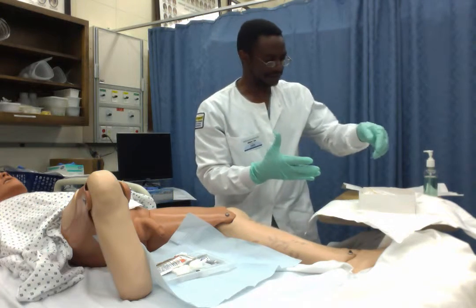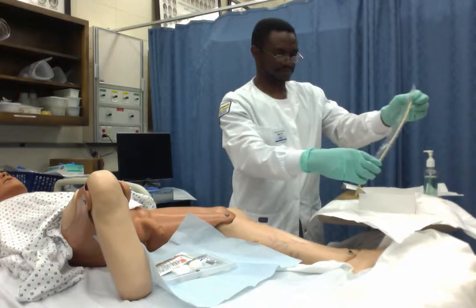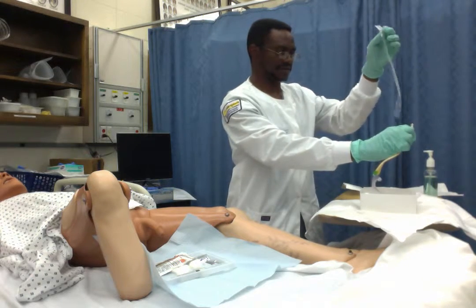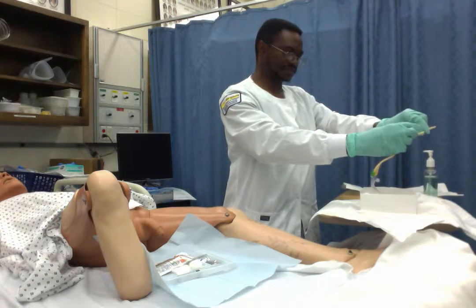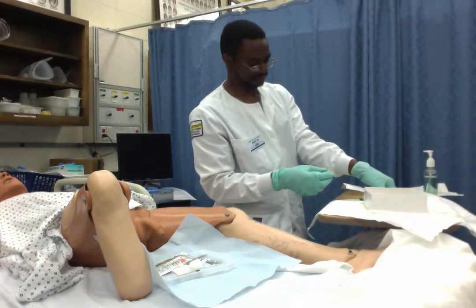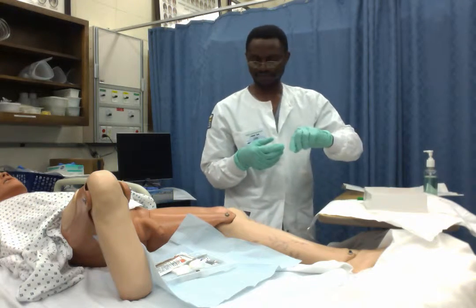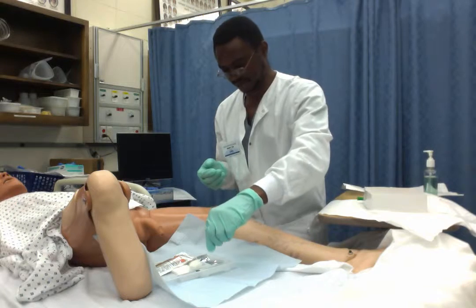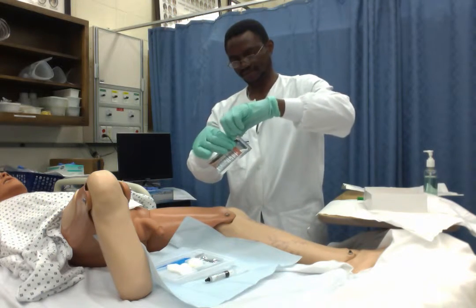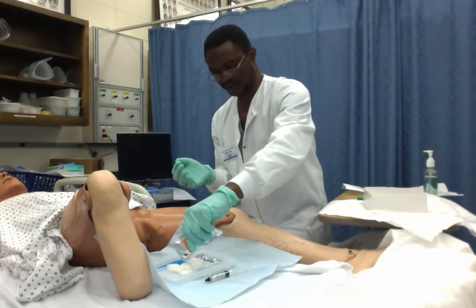I'll prepare my equipment, however, making sure I maintain the sterile field. I wet the cotton bud with my Betadine.